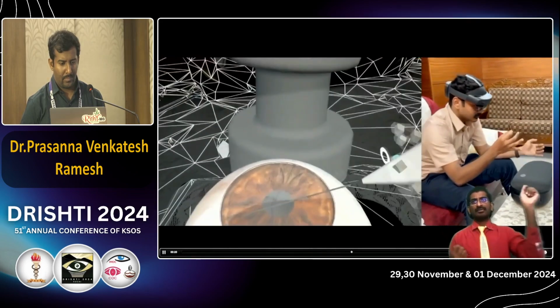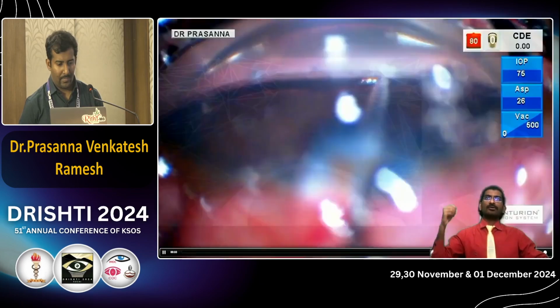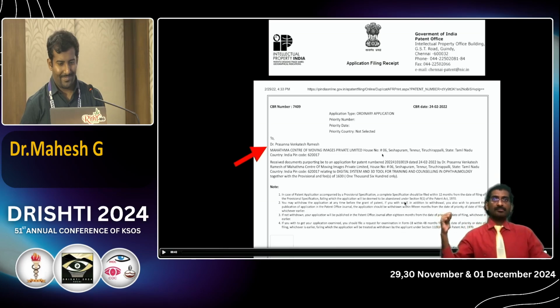So this is me practicing the implantation multiple times, and when I'm in the right channel, a green cube comes in the image behind. So practice this multiple times, and then when I go into my real-time surgical field, my hand-eye coordination is better and I'm able to deliver a good result. And this is a patent-protected innovation of mine, also published in IJO.